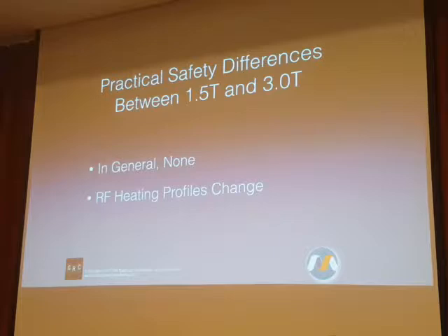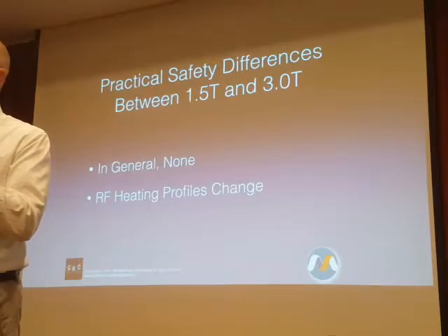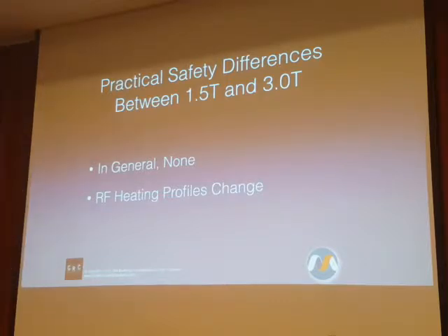At 1.5 Tesla, the perfect antenna for the frequencies we use at 1.5 Tesla is a linear conductor oriented the same direction as the bore. So we're not going across the bore, we're going the length of the bore. A linear conductor that is insulated except for the very tips. The length of that at 1.5, that is the worst case scenario, is between 25 and 30 centimeters.